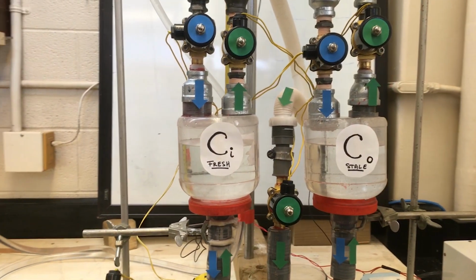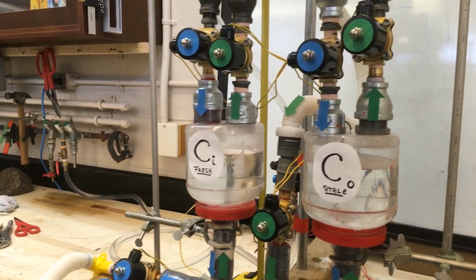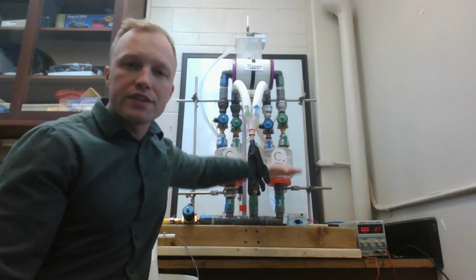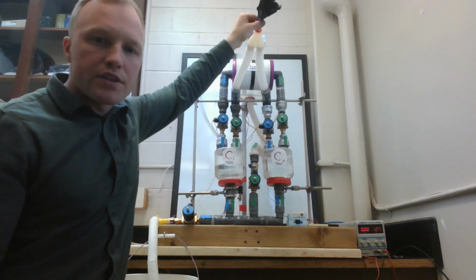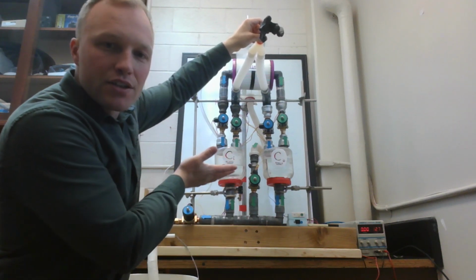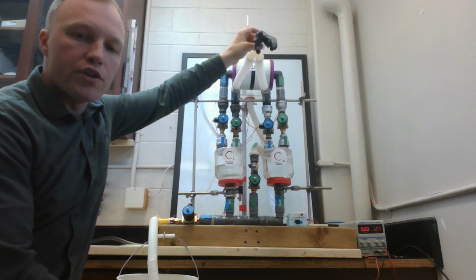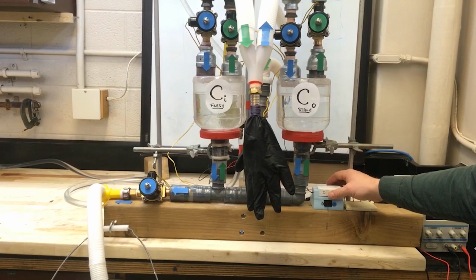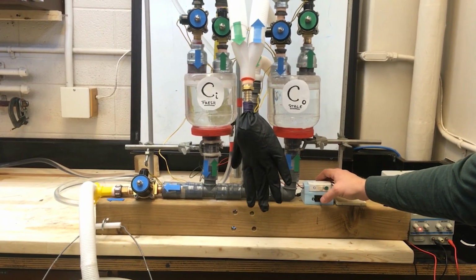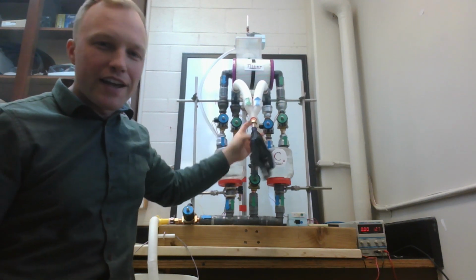On the left, we have only fresh air in this cylinder. On the right, we have only stale air, air that has been breathed out by the body. The water levels in both cylinders rise and fall together. They're controlled by a series of valves. We have green valves, which are water flowing into the cylinders, and we have blue valves, which are open when water is flowing out through the drain. When water flows in, the water level rises in both cylinders, and on the left, that forces air through this tube and into the artificial lung, our vinyl glove for today.